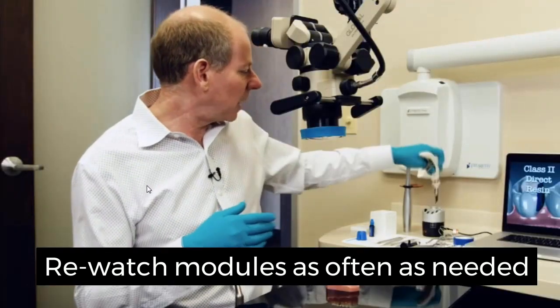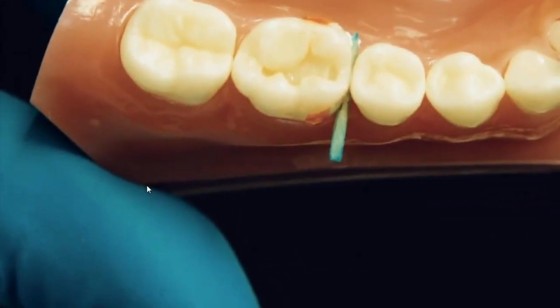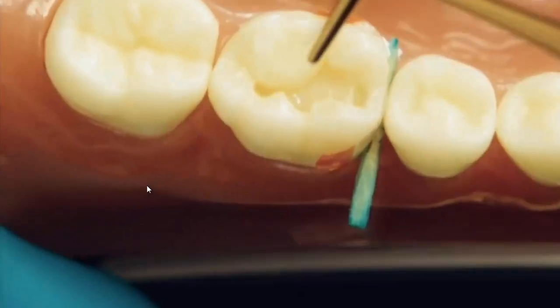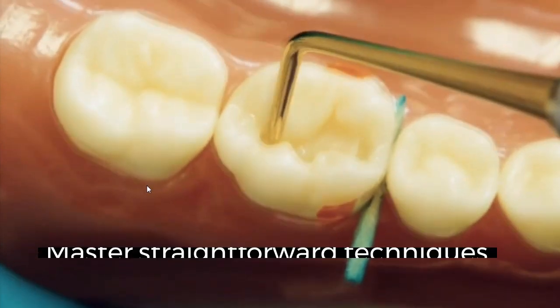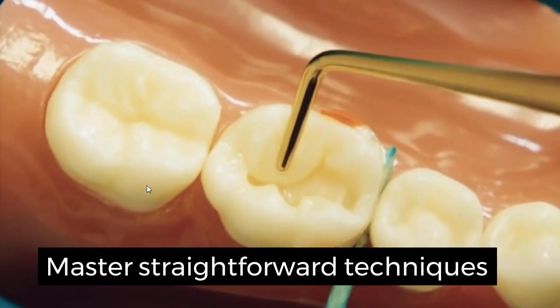I'm going to set my syringe back into the warmer. So I'm going to use the small end of the multi-purpose instrument. Blending the composite onto the cusp.